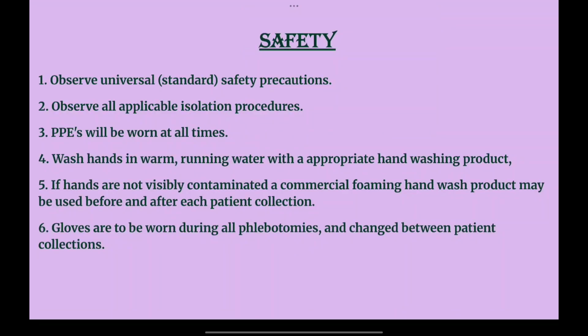Now the safety precautions that should be followed in order to contain the infection as well as to be aware of whatever procedure you are doing. Safety is a must for both the patient as well as the healthcare professional who is performing the procedure. Now you should observe the universal standard safety precautions. These are universally followed standard precautions that should be adopted by every healthcare professional.